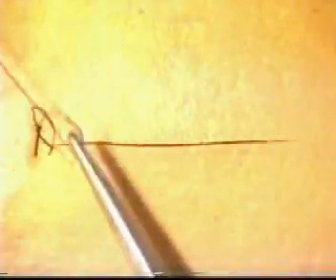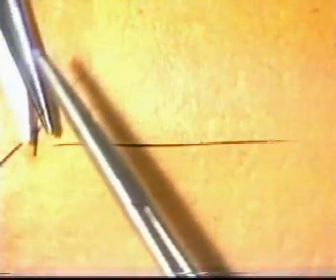However, in this situation just cut the short end and hand the long end of the suture to your assistant who will follow you during this procedure.